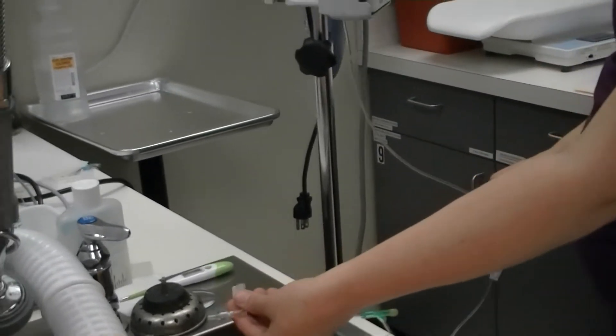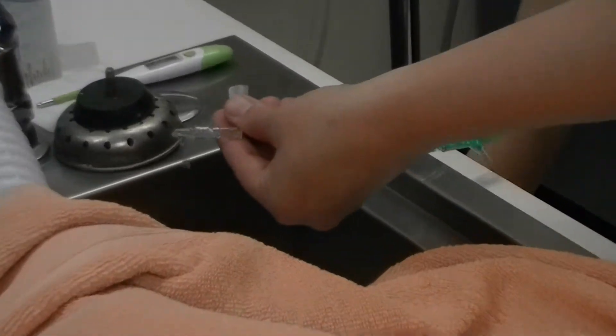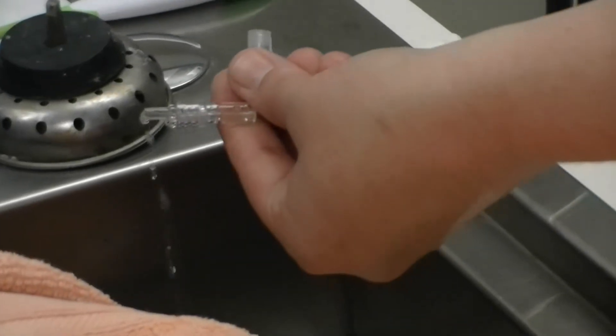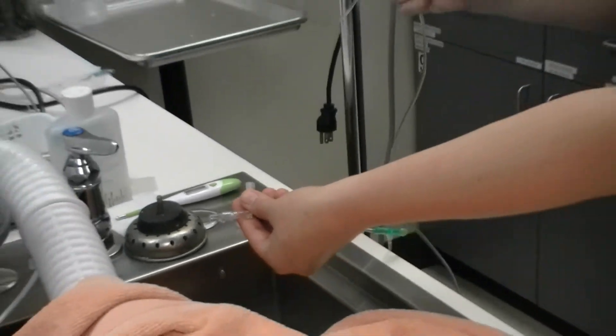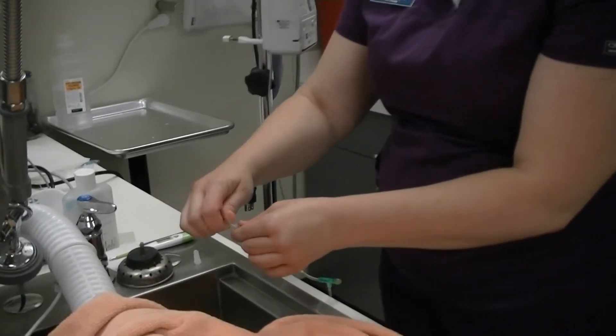This is what we call bleeding the line — we're filling the line with fluid so that we don't put any air into our patient. That's why we want to get rid of all the bubbles. Once I'm happy that it's bubble free, I'll go ahead and use my toggle to clamp it down, and keep everything nice and clean and sterile.